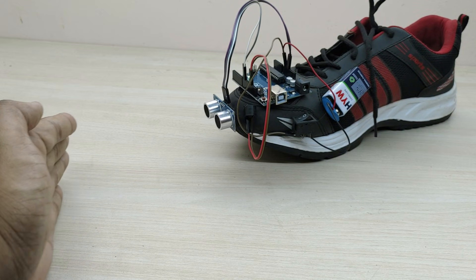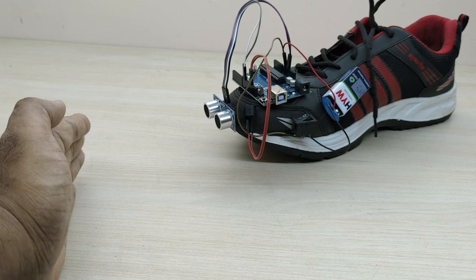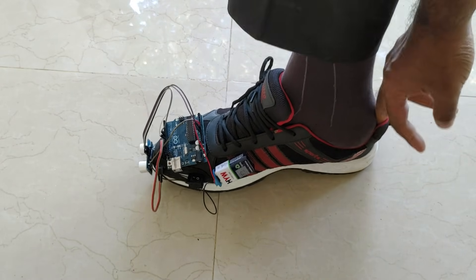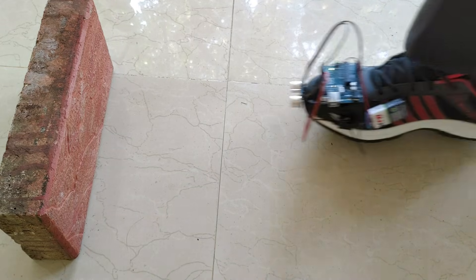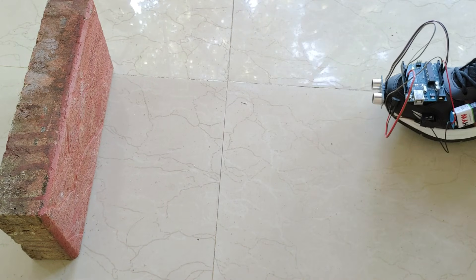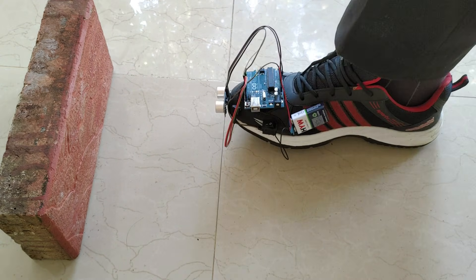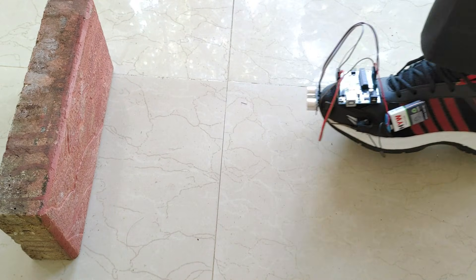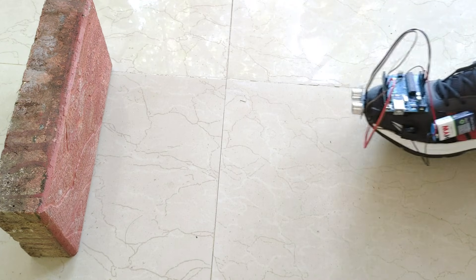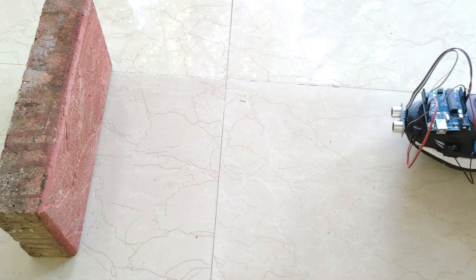The project is working nicely. Now let me wear the smart shoe and do the testing. The smart shoe is working very nicely — it is detecting the obstacle and giving an alert to the blind person effectively. The alarm will be continuously on as long as the obstacle is in front of the smart shoe.